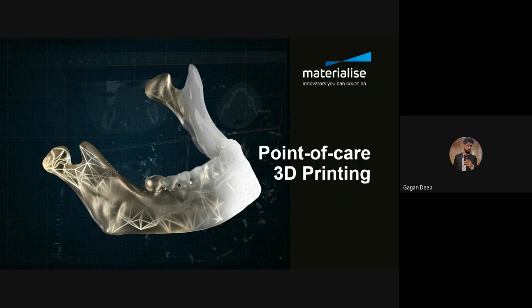So you have a radiology department, or you have a dedicated 3D printing lab where you can install the software for pre-planning and for designing of implants, and you have a small desktop printer also. If you are just starting, you can start with a small desktop printer like Formlabs or Ultimaker printers, where you can design and print cutting guides, splints, and so on.